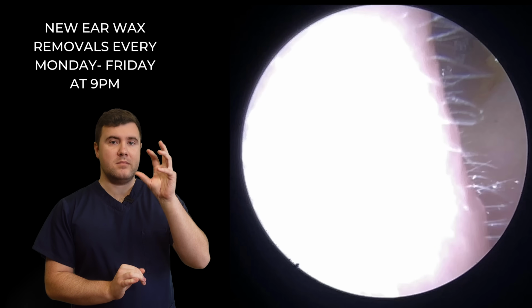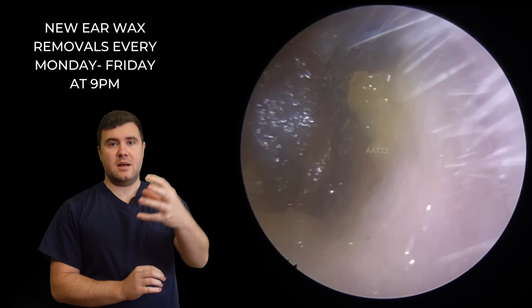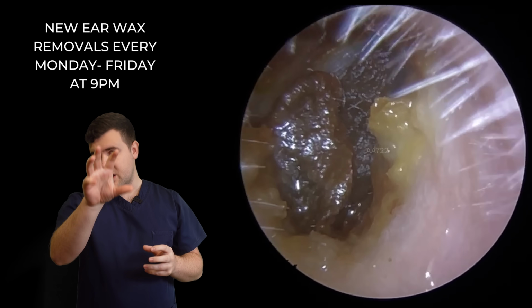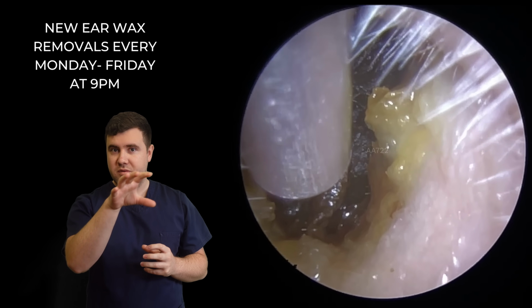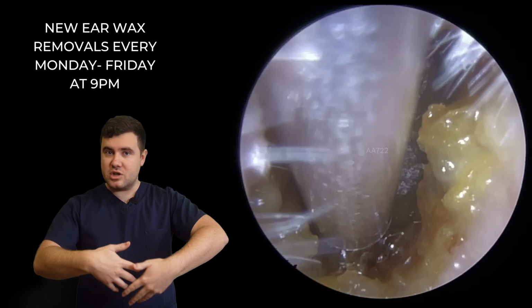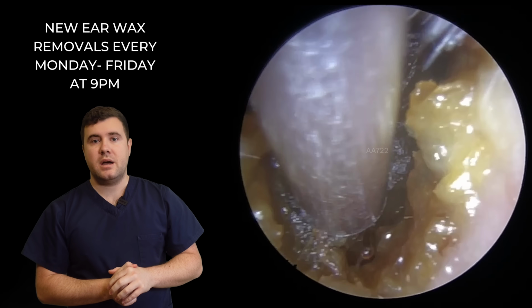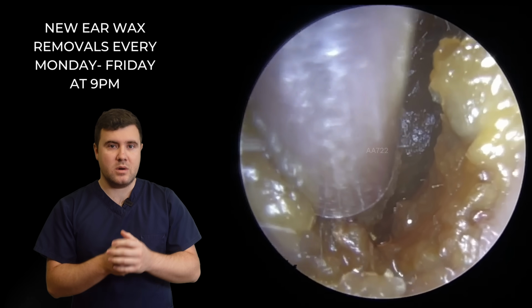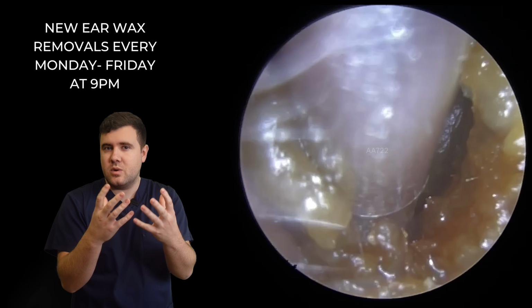So this is my patient here. This patient's come in to see us having some difficulty with the hearing, quite humid in the ear as well. You could see just before we went in with the suction, the camera just kind of steamed up straight away, which is very common with most ear canals. We do see quite warm, humid ear canals quite a lot.